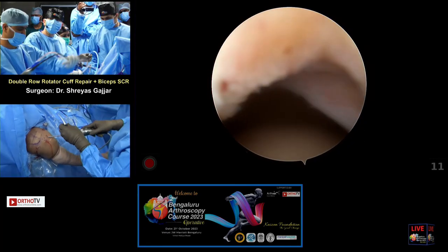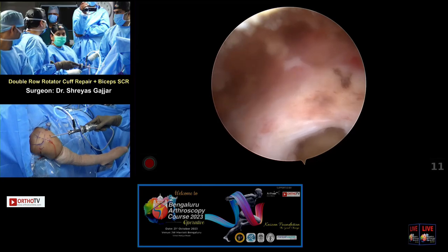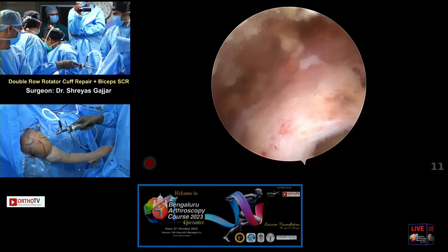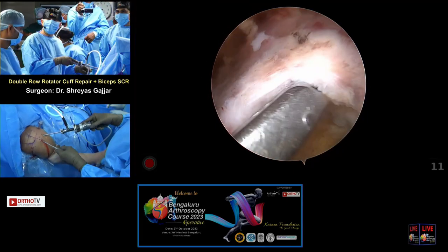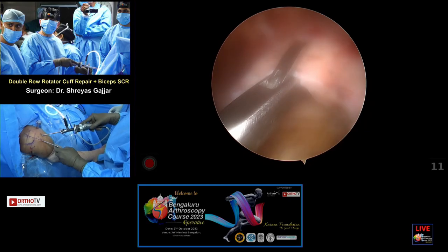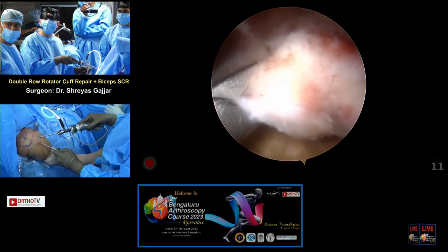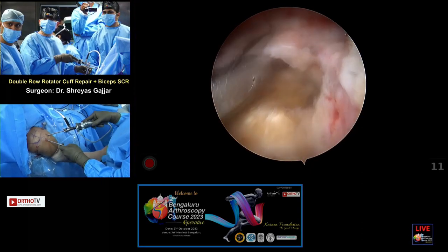How do you determine the shape of the tear, whether it's a U-tear or an L-tear? Can I have a suture retriever, please? Determine on vision. Here you can see, this is like a C or a U-shaped tear. And I use an atraumatic tissue grasper to ensure this is the reduction we are looking at back on the footprint. So it's looking nice.